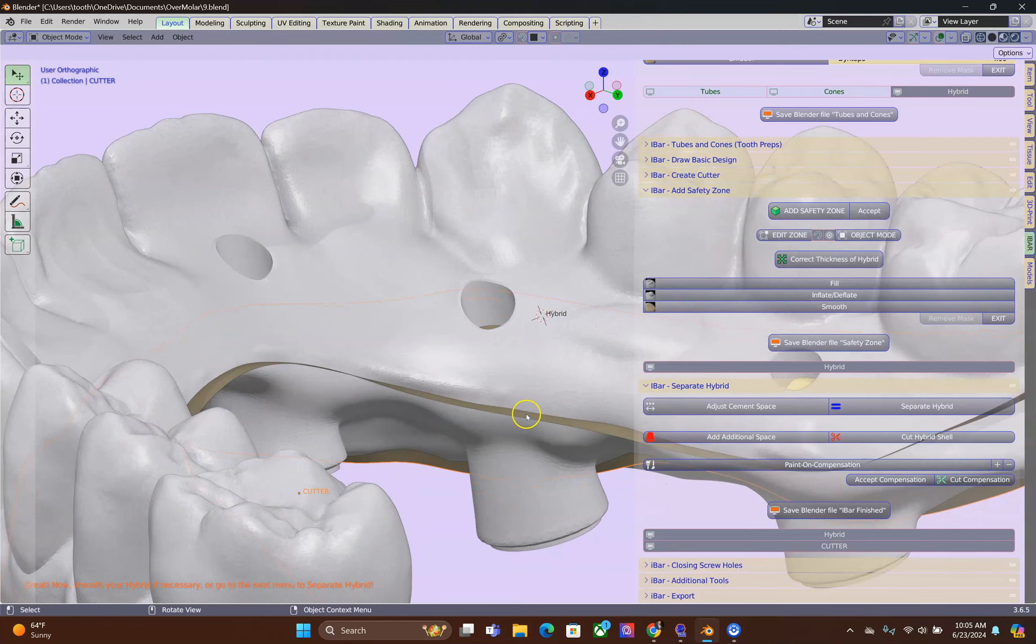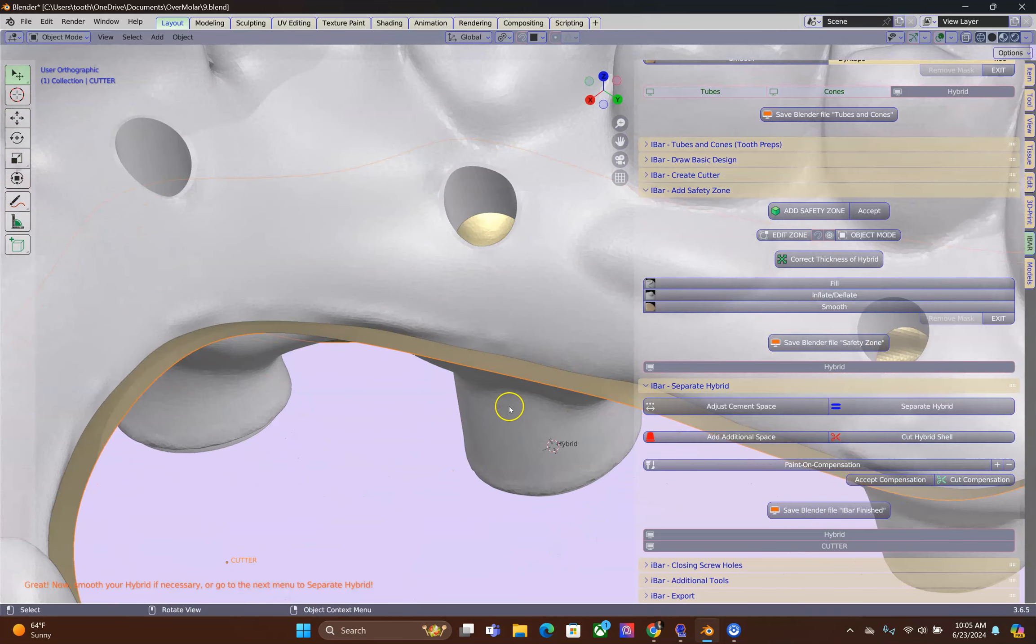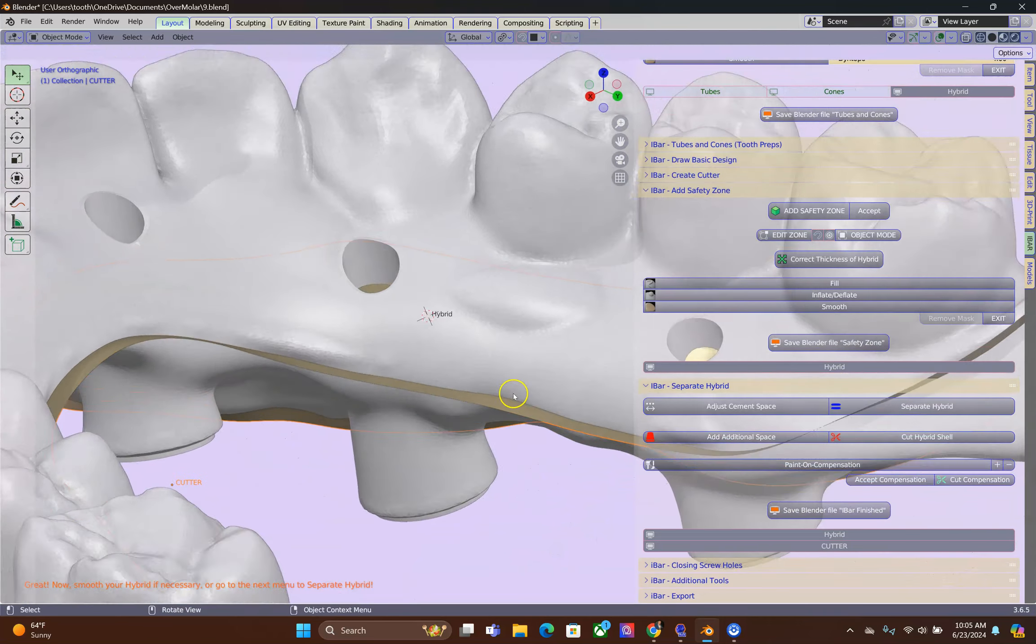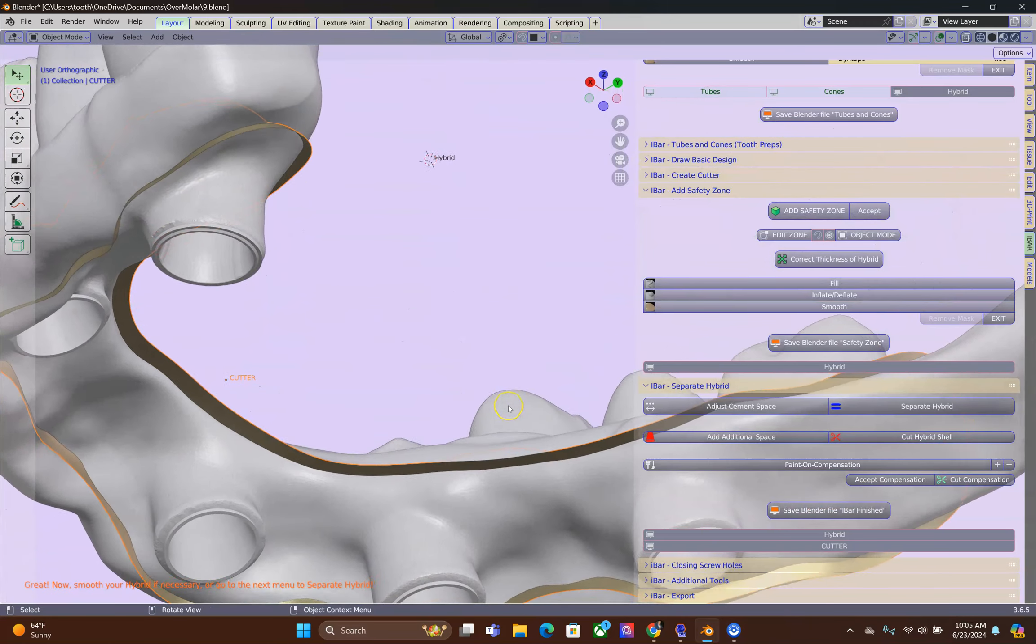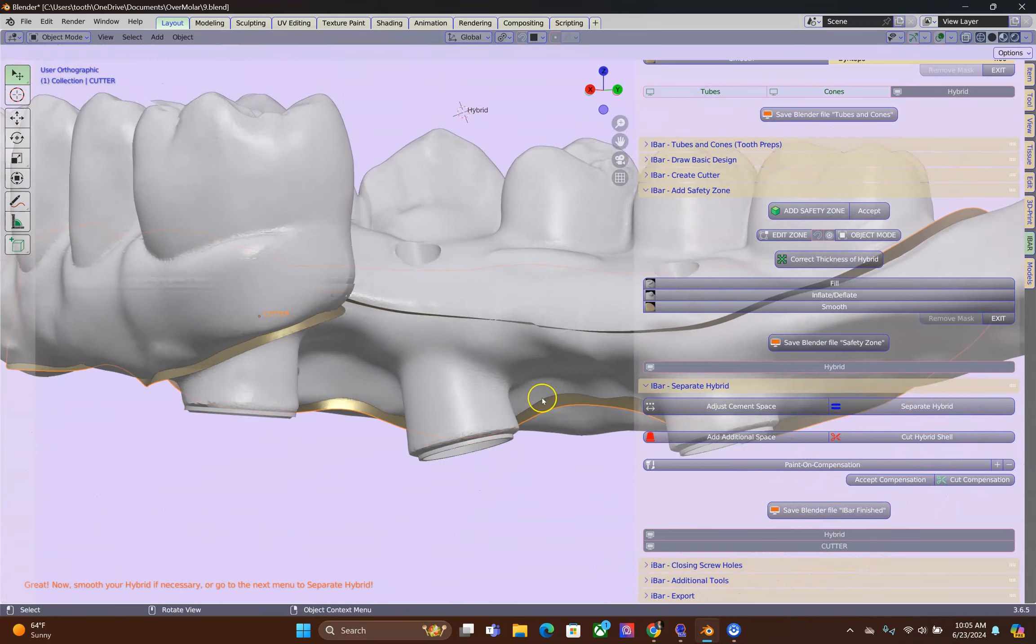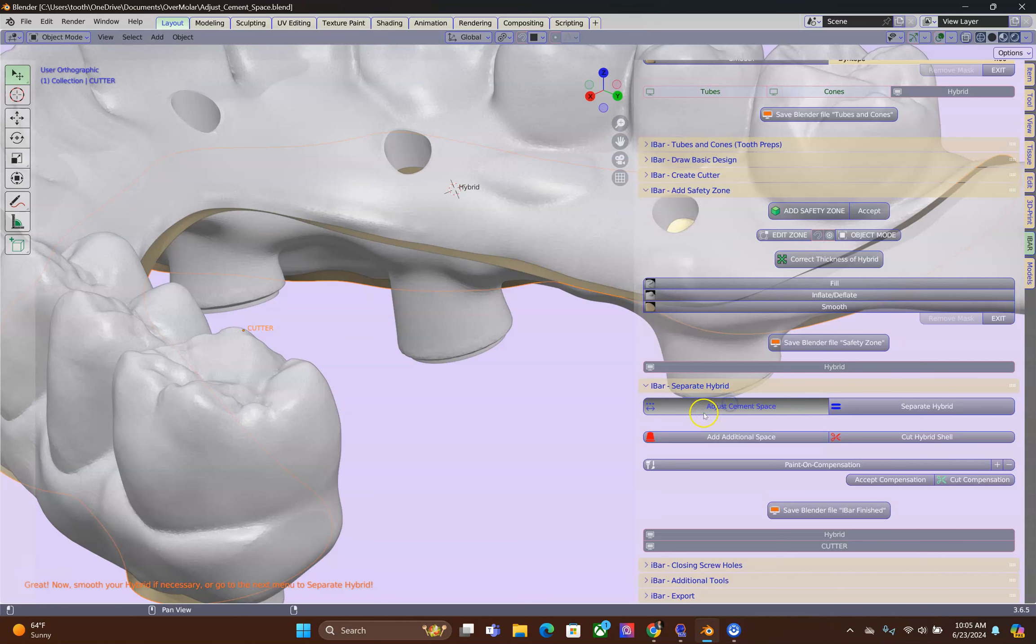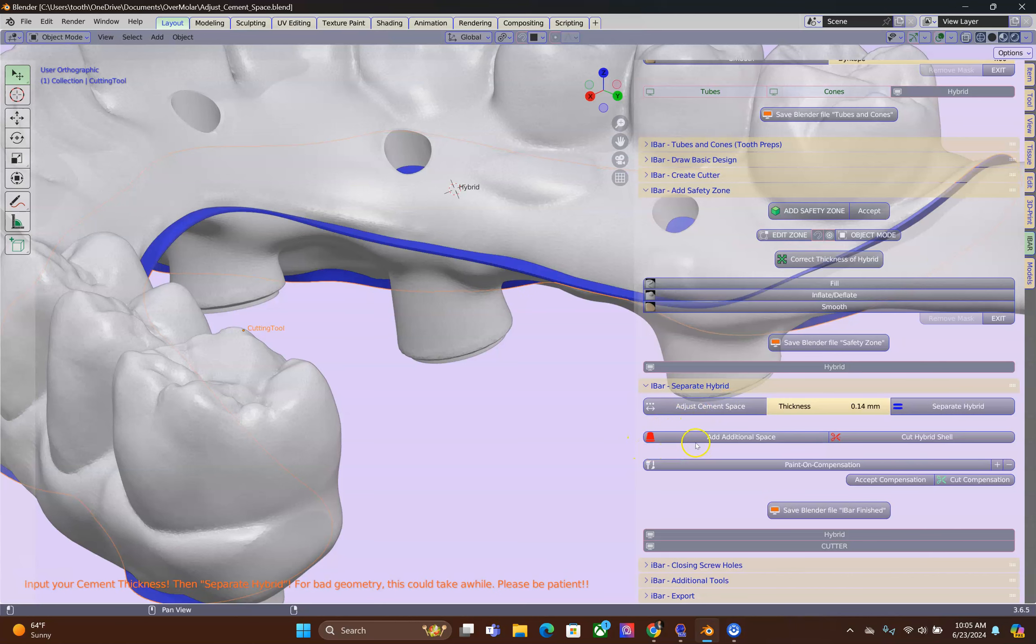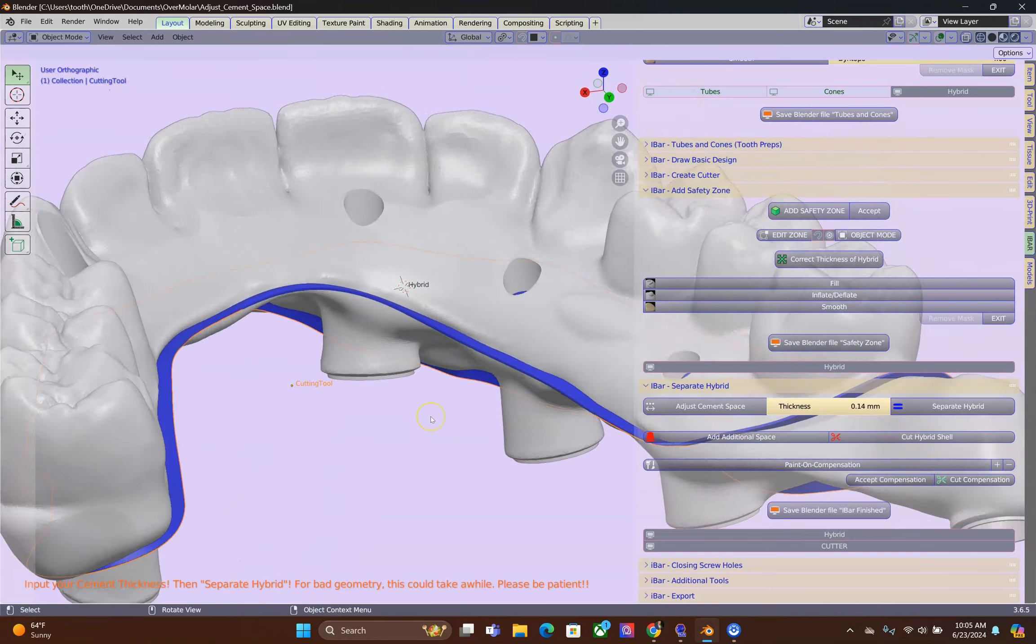Now, it is important to select your cutter because you may have more than one cut on the scene. Then, click on Adjust the Cement Space. I am not going to engage in the additional space in this video.